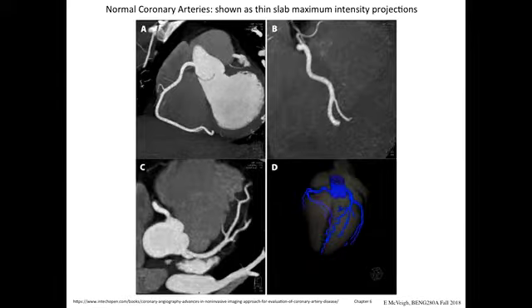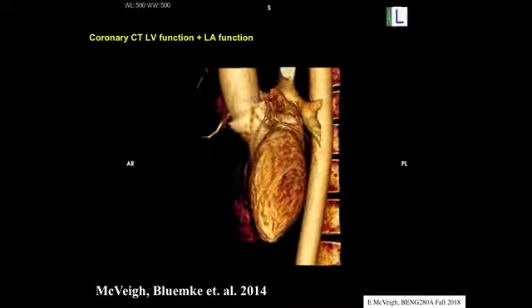Right? And so if you're looking for, say, coronary artery disease in a person and you want to quickly see if it's there, you pull this up and you know immediately whether or not that vessel is blocked or open, etc. So again, that is because it's three-dimensional data. So we can take a look at subsets of that data quite well.